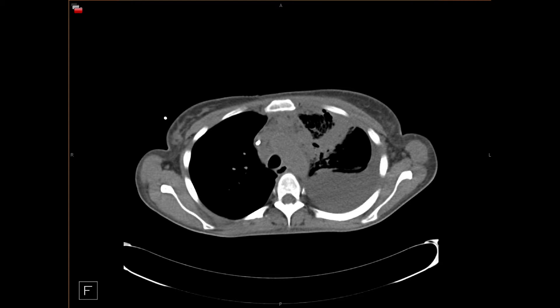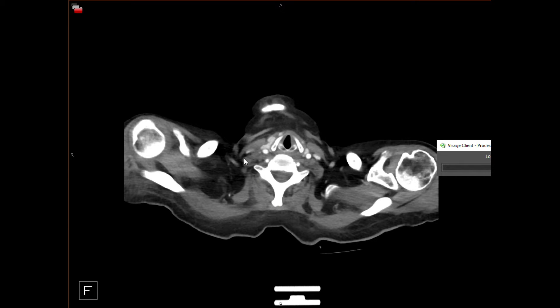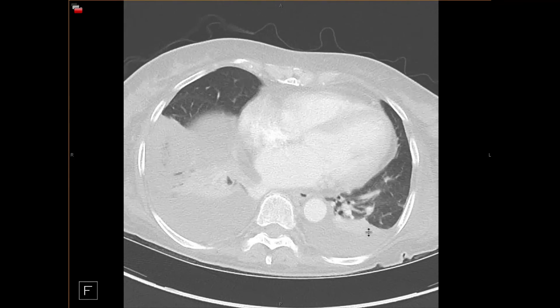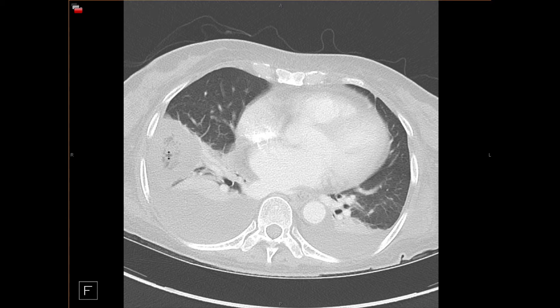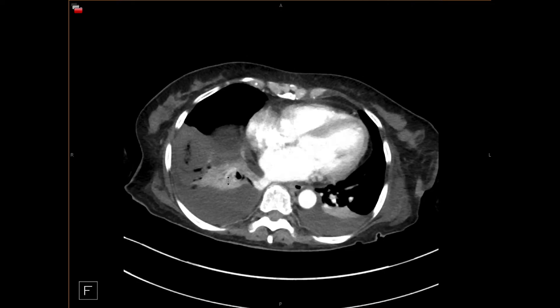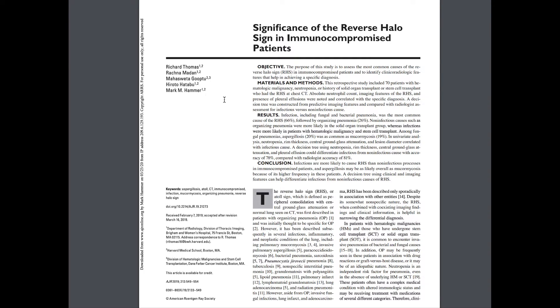Patients with aspergillus alone can also develop the reverse halo sign. Here is an example in the right lower lobe — a large area of consolidation with central ground glass, with the entire region of consolidation non-enhancing compared to the enhancing atelectatic lung. Even though we suspected mucormycosis based on imaging, biopsy confirmed aspergillus. In fact, our published series found nearly similar prevalence of aspergillus and mucormycosis in immunocompromised patients. But if you see the reverse halo sign, you should raise the possibility of mucormycosis so the clinical team can decide and pursue biopsy.